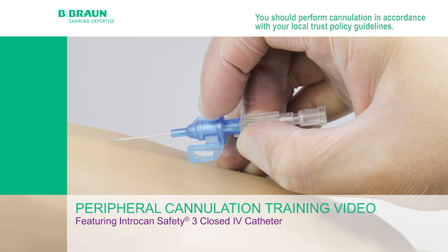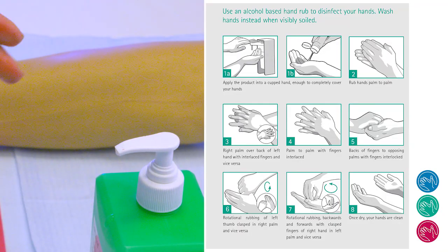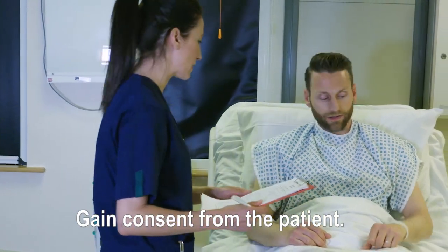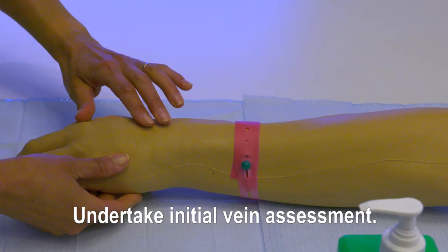You should perform cannulation in accordance with your local trust policy guidelines. Steps prior to procedure: alcohol gel your hands, gain consent from the patient, and undertake initial vein assessment.